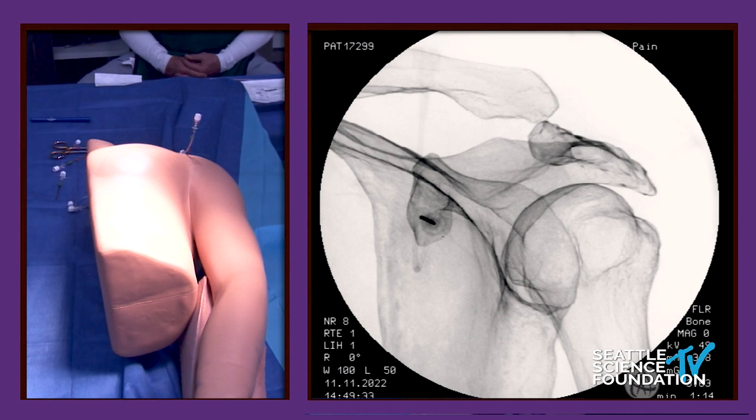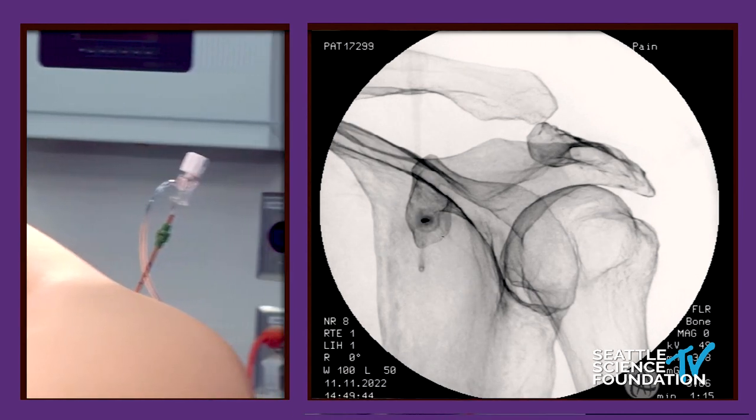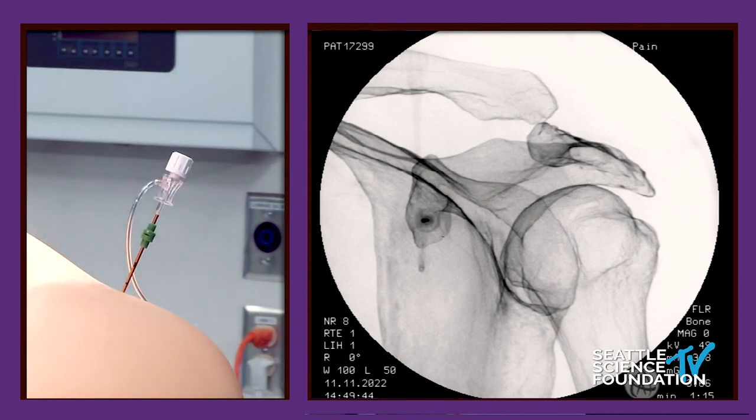And then if you just go a little cephalad to that, touch down on bone — you can see what the hub, what the lesion would look like. We would just want that to be right in the middle of the coracoid process. And that's it, guys. We burn there, check motors, make sure that's negative. Two and a half minutes — we've now... that is just beautiful. Good work of art. Well done. Thank you. That's cooled RF of the shoulder, and I'll pass it off to Dr. David for Nimbus.